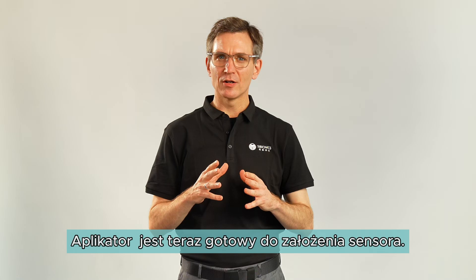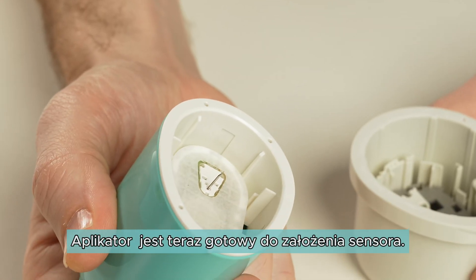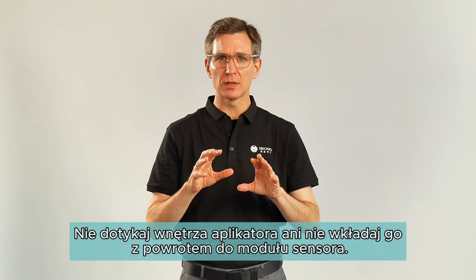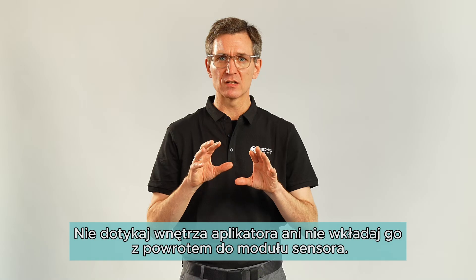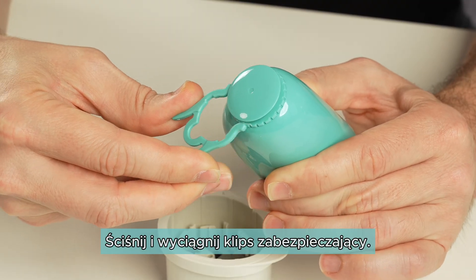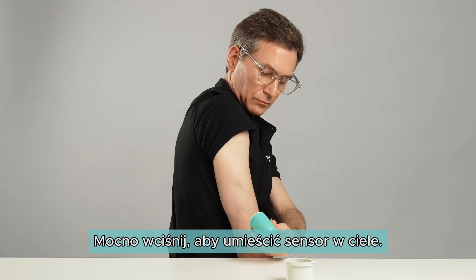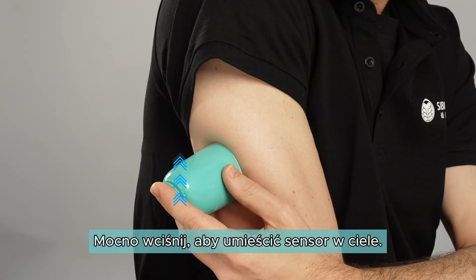Lift the sensor applicator out of the sensor pack. The sensor applicator is now ready to apply the sensor. Do not push down on the applicator button until you place it over the prepared site. Squeeze and pull the safety clip out. Place the sensor applicator over the prepared site. Push down on the button and apply the sensor.